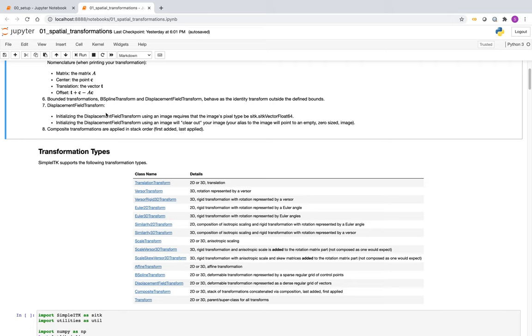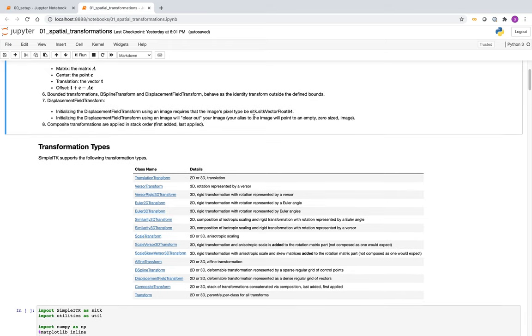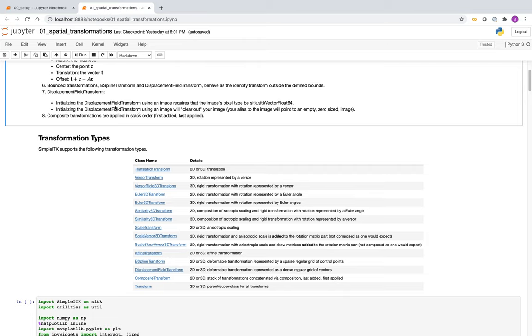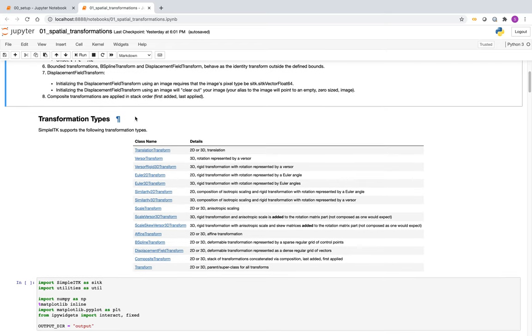The displacement field transform is memory intensive and its pixel type is vector float 64, providing precision at a cost of memory. Once you give an image to the displacement field transform, it consumes it and the image is zeroed out — we don't want to keep multiple copies of data. Composite transforms are a convenience type that allows combining multiple transformations in a stack-based semantics where the first added is last applied to points.